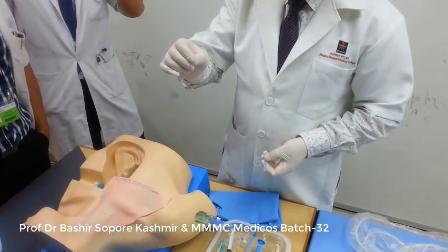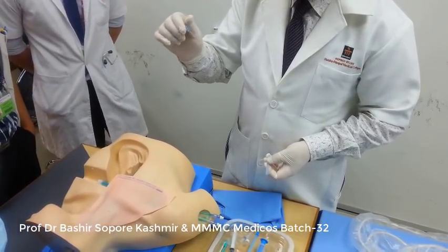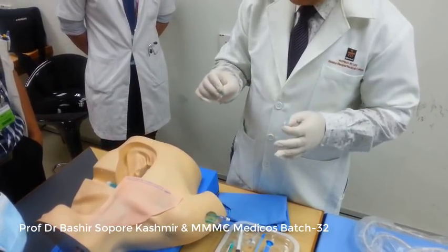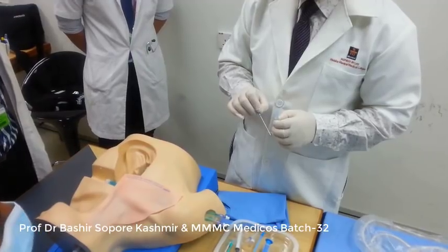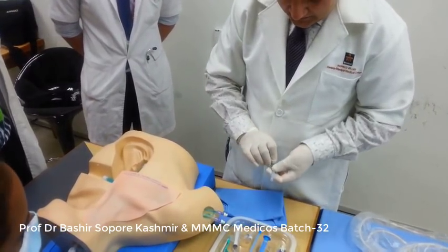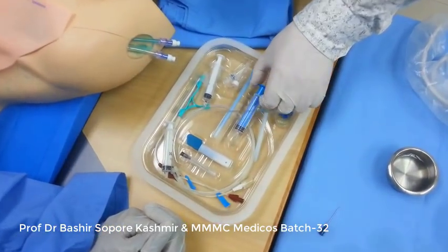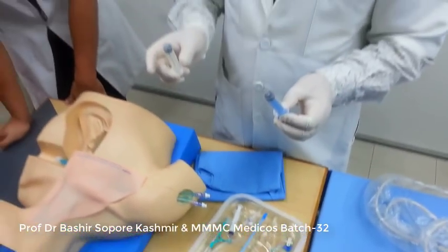So please don't forget that after the local anesthesia we have to use the needle finder. We have to use the needle finder to find the internal jugular vein, and after the needle finder we have to introduce the introducer needle, which is a big bore needle around 2.5 inches in length, and this also is attached to a 5 ml syringe.